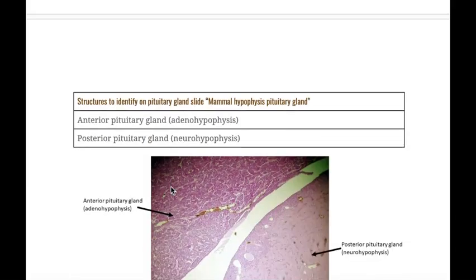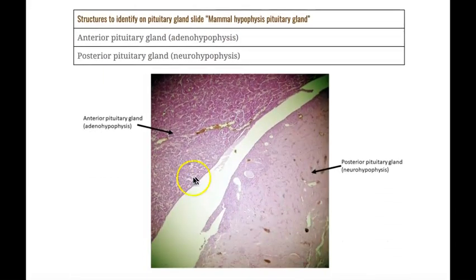If I continue down, here is the pituitary gland. There is an adenohypophysis or anterior pituitary gland, and then a posterior pituitary gland or neurohypophysis. They're actually fundamentally different structures, even though they're part of the same gland overall. The anterior pituitary, you can see, is more dark purple. There are clusters of cells. They should remind you of acini in other areas, and that's because it is glandular structure, and these are all producing hormones.